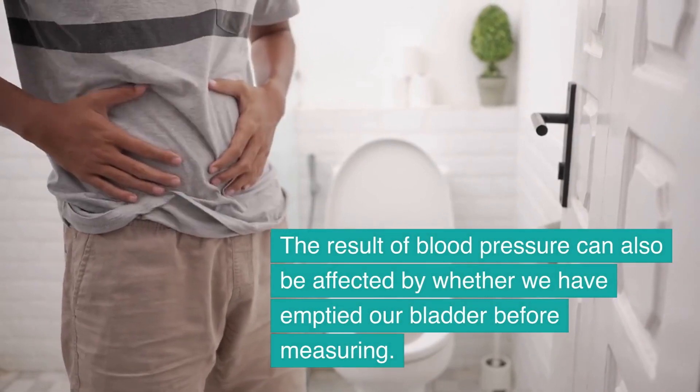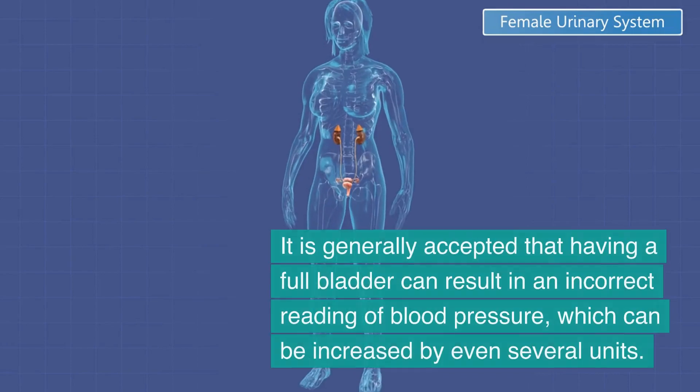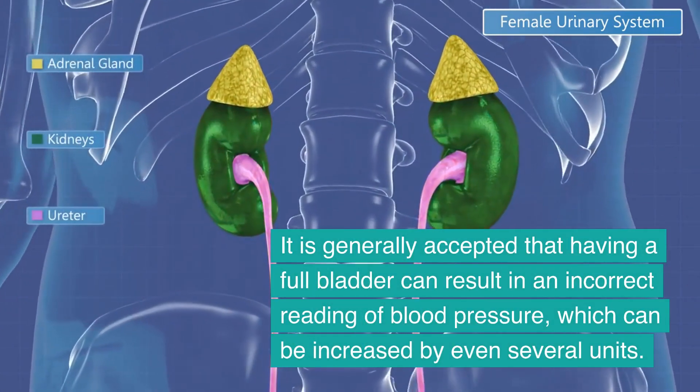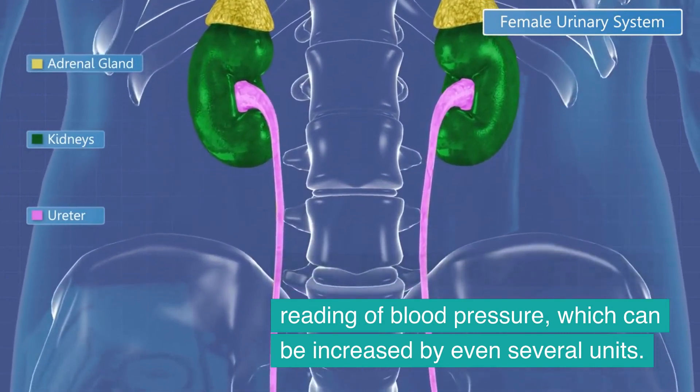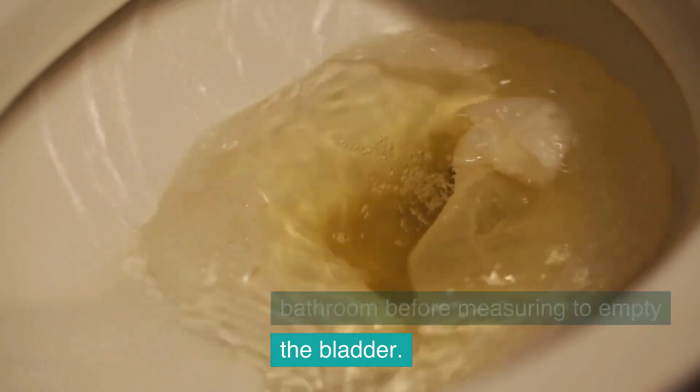The result of blood pressure can also be affected by whether we have emptied our bladder before measuring. It is generally accepted that having a full bladder can result in an incorrect reading, which can be increased by even several units. Therefore, it is good to use the bathroom before measuring to empty the bladder.